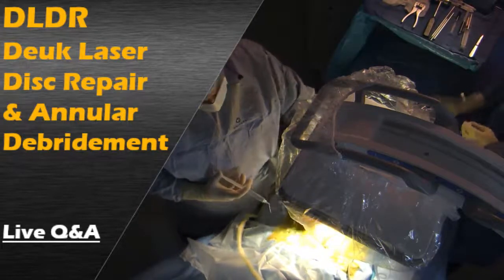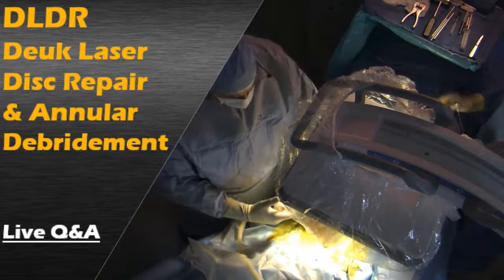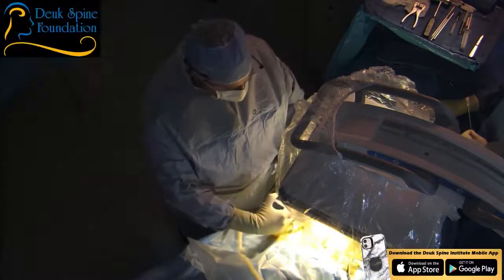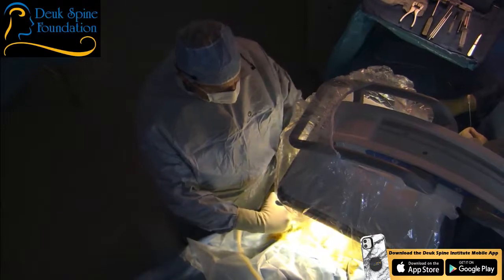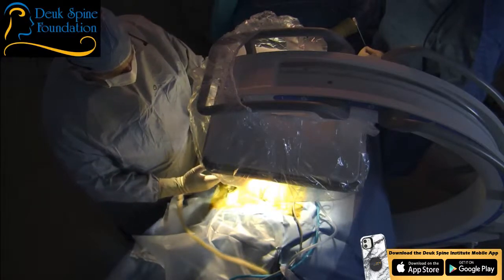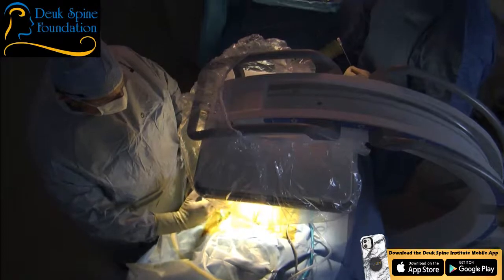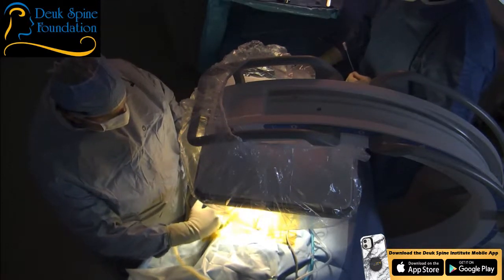You feel my hand back here? That's just my hand. I'm going to give you a little poke with a little stick and burn. That's just the numbing medicine going in. That's the worst part. Just relax. Everything's going to be okay. It does burn, huh? Well, that'll be over in just a minute if you're just patient with me.